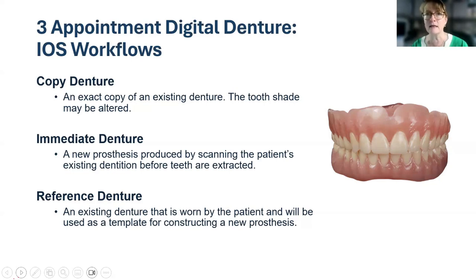But denture scans have really taken a forefront in the last probably 3 years, probably because of demand. The doctors demanded it. You invest into a piece of equipment and you want to be able to use it for everything. And thank goodness the scanner manufacturers like Envista recognized that and made alterations to their own systems to be able to do it and do it well.